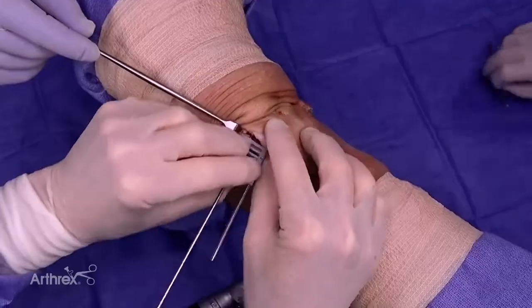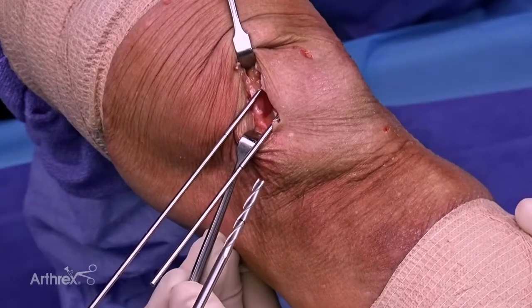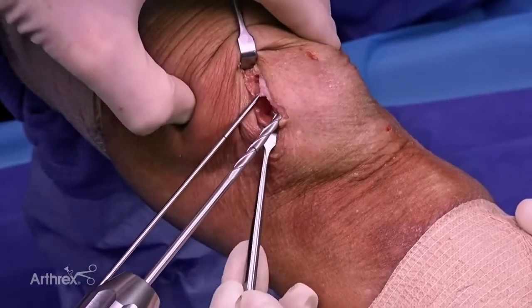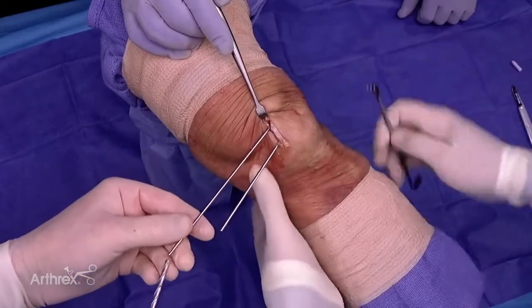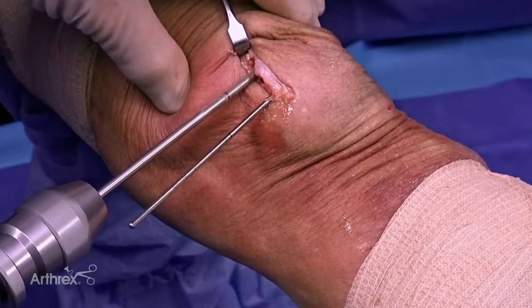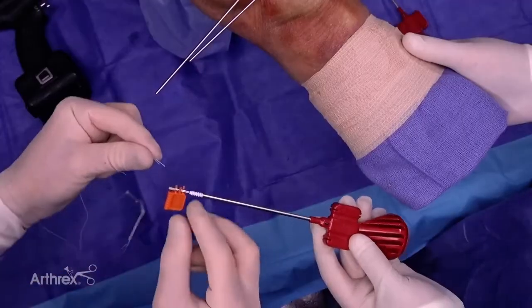Now we're going to over-drill the pins. The guide comes off. We over-drill with our 4.0 drill bit to the depth of the laser line. We do our equator pin first — we've reamed over our equator pin — and then this is our more proximal pin. Again, we go to the depth of the laser line with the 4.0 drill.